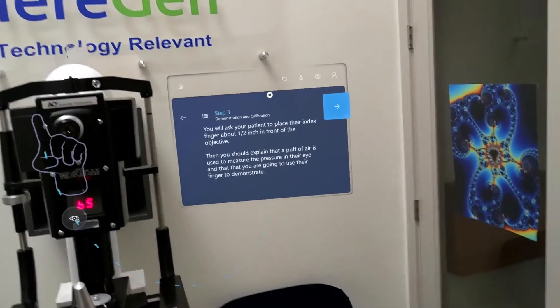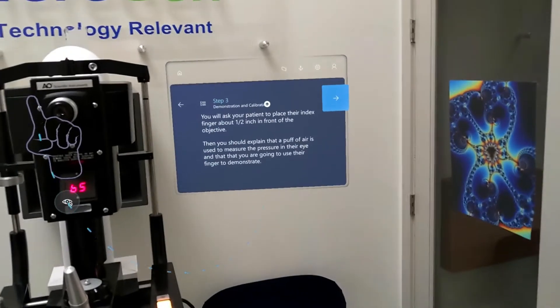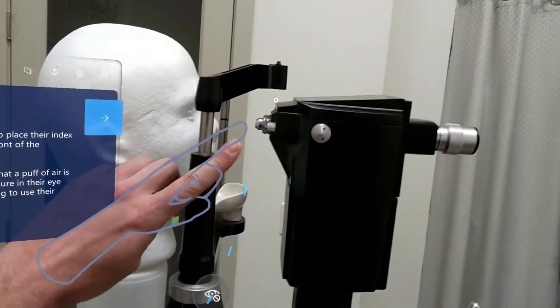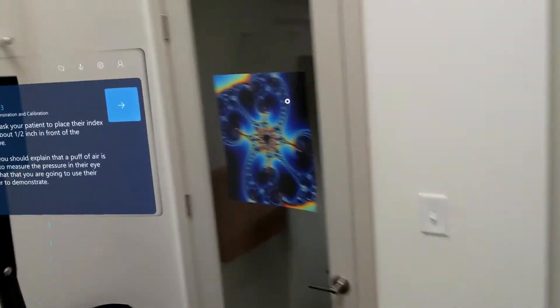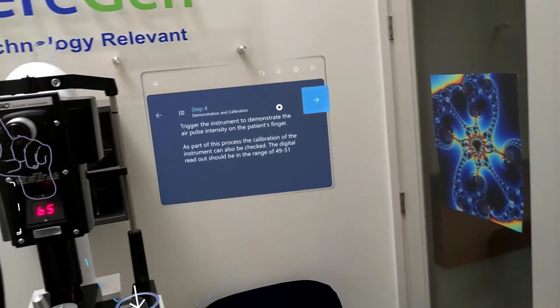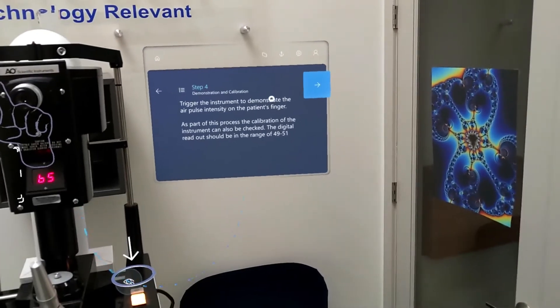You'll ask your patient to place their index finger about half an inch in front of the objective. Then you should explain that a puff of air is used to measure the pressure in their eye, and that you are going to use their finger to demonstrate. Here we have another mixed reality hand showing me exactly where I would want to show the patient where that puff of air might come. Trigger the instrument to demonstrate the air pulse intensity on the patient's finger. As part of this process, the calibration of the instrument can also be checked. The digital readout should be in the range of 49 to 51.